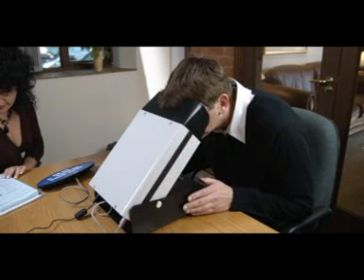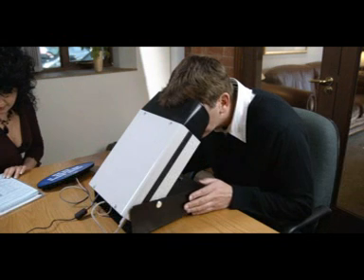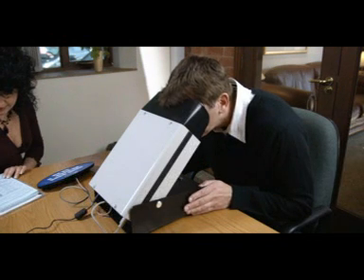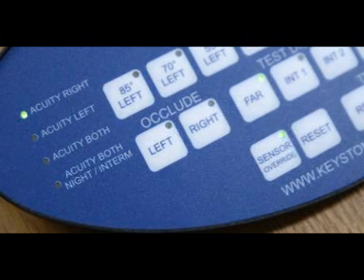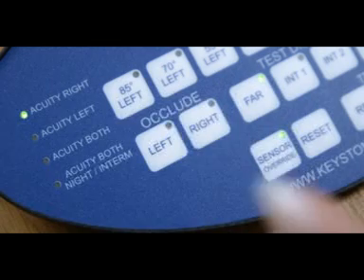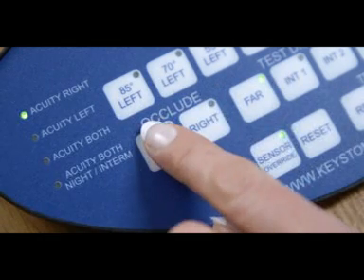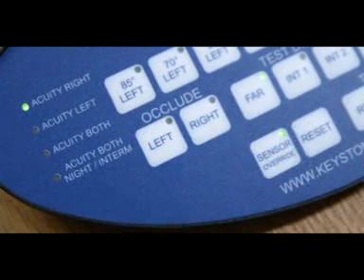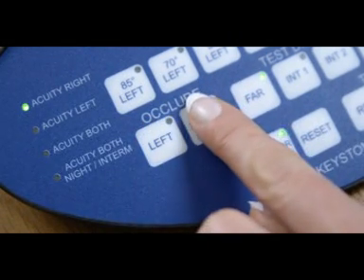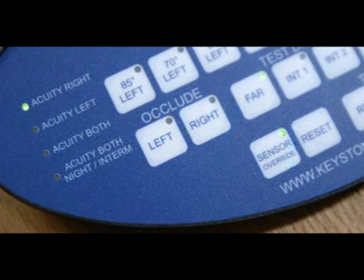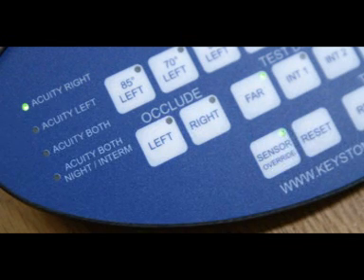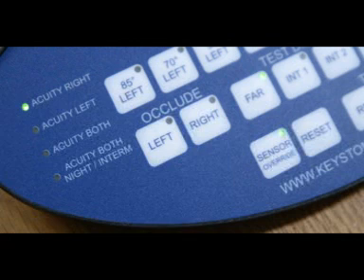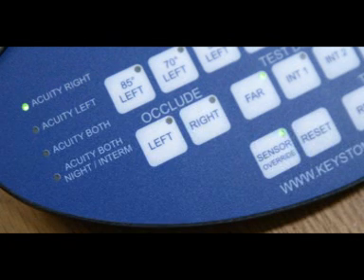All tests are given with both eyes open. The occlude buttons on the control panel for left and right eye are to be used for the right and left eye acuity tests on the rare occasions when it may be desirable to test one eye without the other eye seeing. Please see the instructional manual for more details on this.